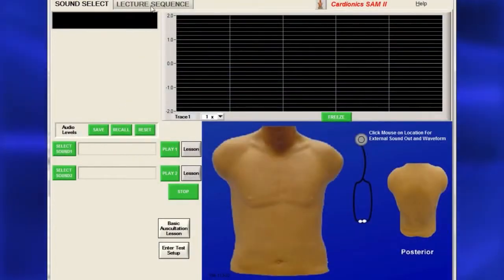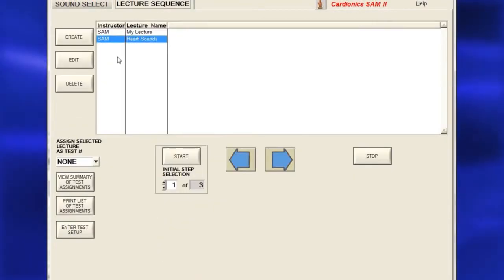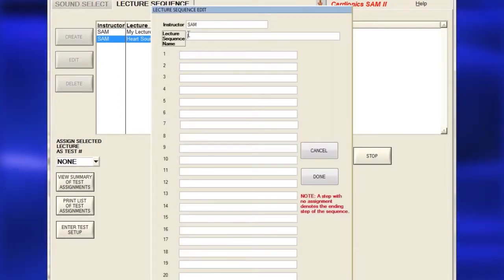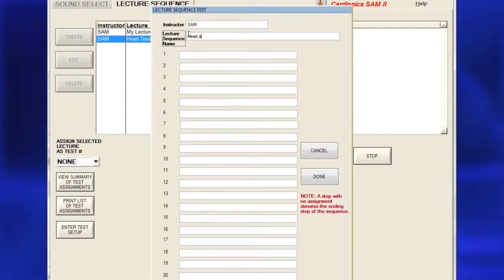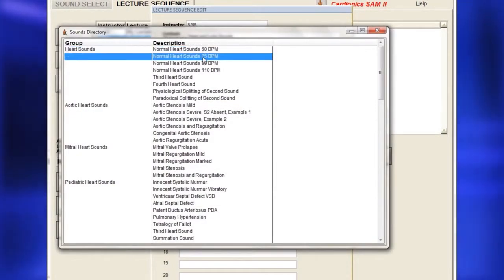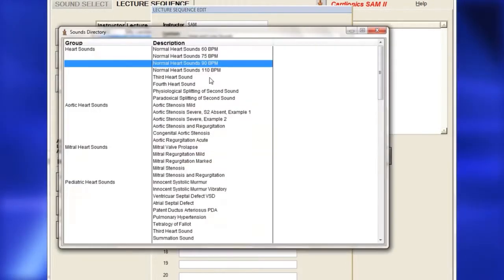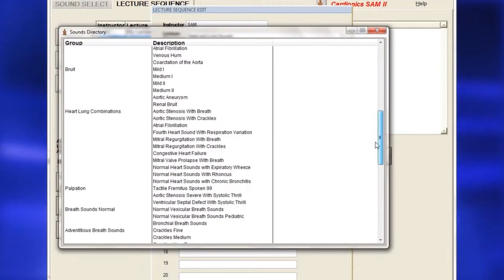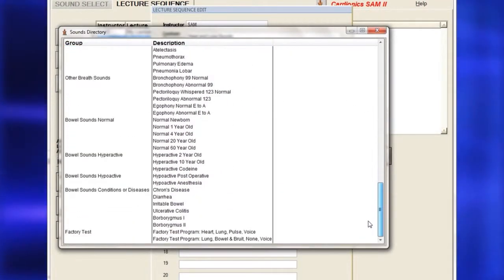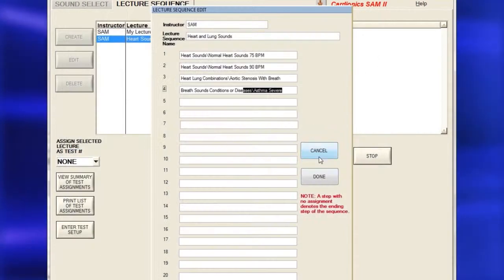To set up a lecture on the Lecture Sequence page, click Create to bring up the Create Lecture page. Enter the instructor's name, then the scenario or lecture name. Next, double-click on a sound number to open the sounds menu. Double-click on a sound title and wait a moment for the sound to fill in the selected sequence. When finished selecting sounds, click Done.